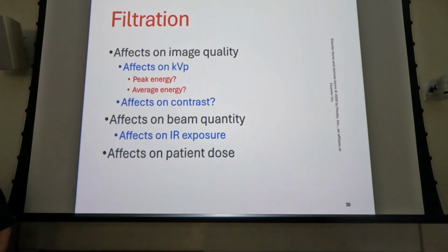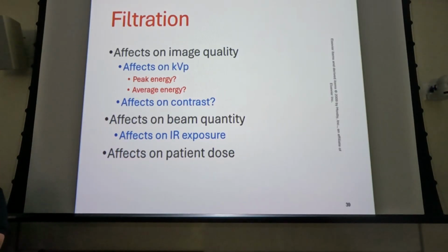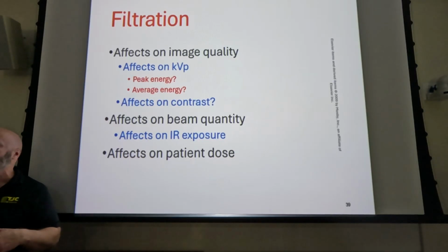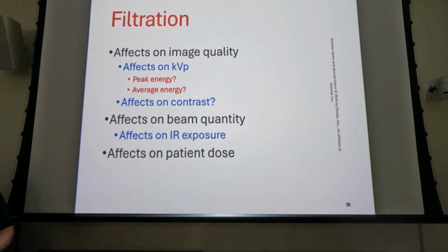What you'll see and hear the beam referred to as, as average or KVP goes up, is that it's a harder beam, okay? So it's a higher quality beam. KVP controls your quality, so even in the entire spectrum, if our KVP doesn't go up but our average increases, we still have a better quality X-ray beam. More likely to penetrate. Penetration equals quality. So it will affect our quality. It doesn't affect our peak energy, it does increase our average, really no effect on contrast. The quantity does go down though.